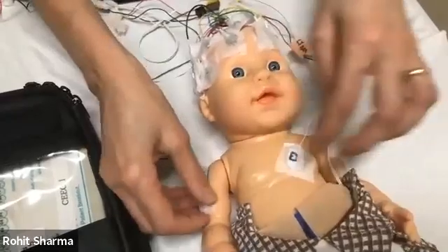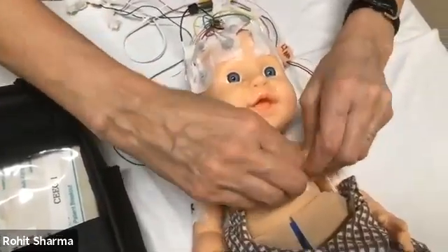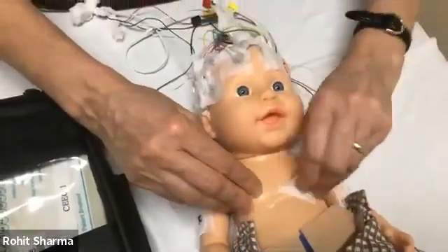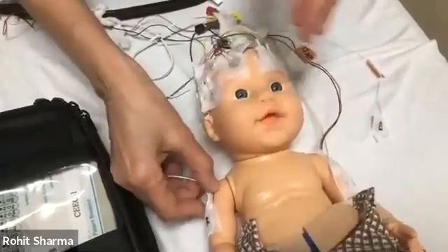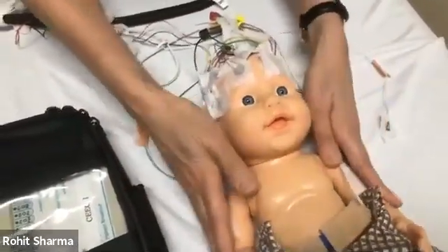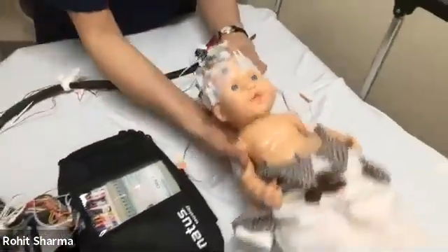So once you peel them off, the hot ones comes off faster. Try to get her off. It's been on there for a while. So if you notice, take all of these off. So pretend they're all off. Then the baby is free to be able to go to CT or MRI.